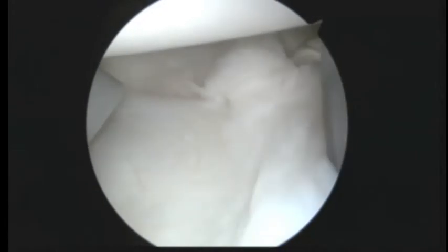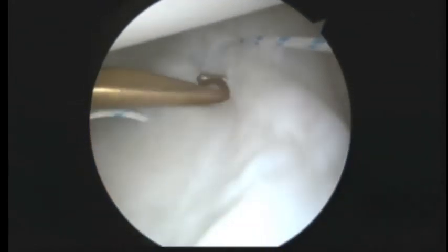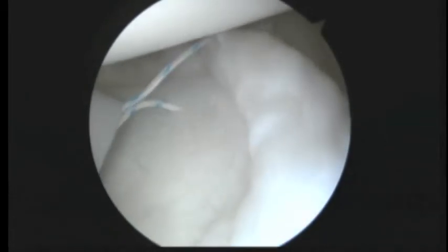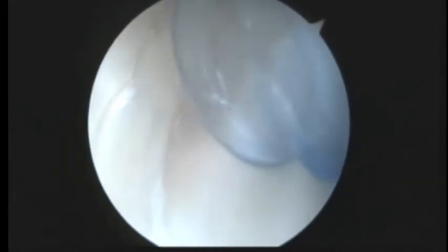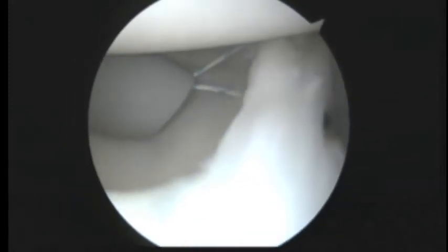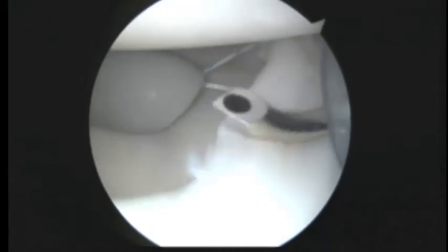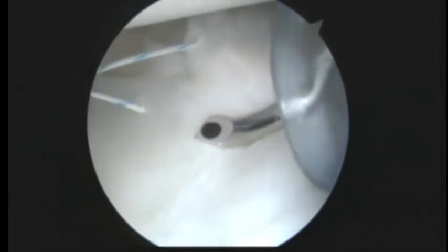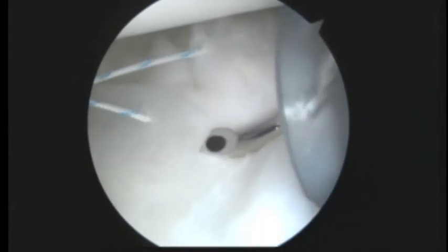Get it down and through and show you some more in just a minute. Okay, you can see we've got the first stitch passed. And now, just like we did in the back, we're going to do a figure 8. So we're going to take this anterior suture and bring it posterior. And then we're going to take our suture hook and make a second stitch somewhere in this region here.